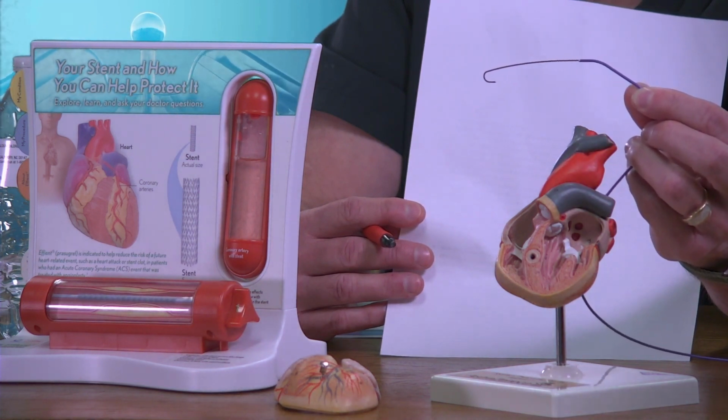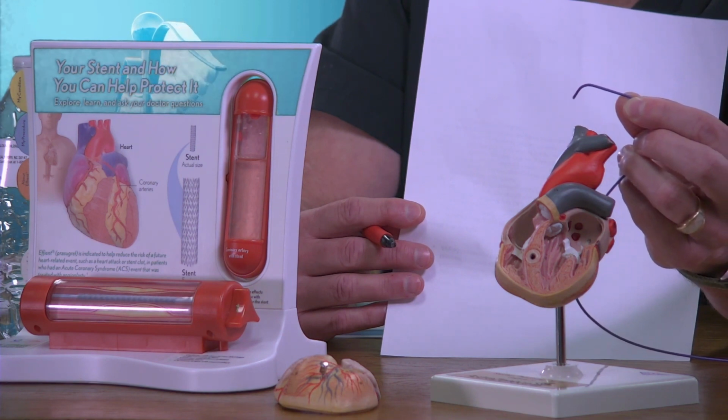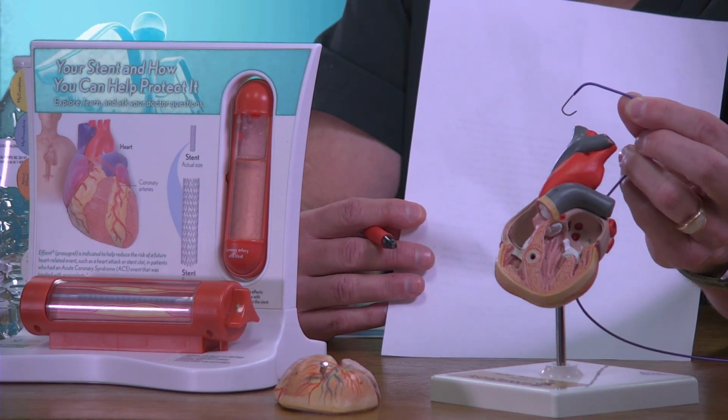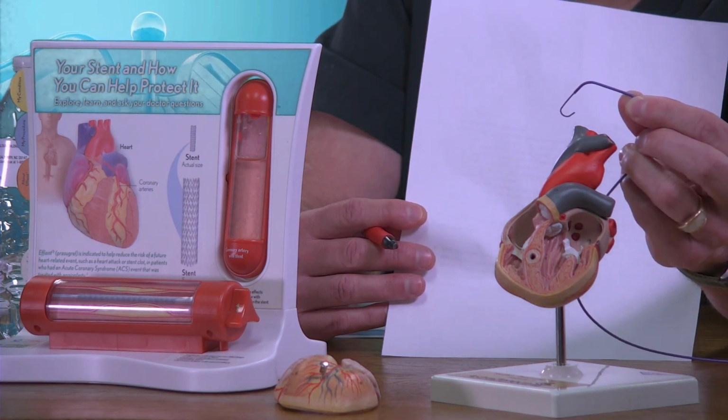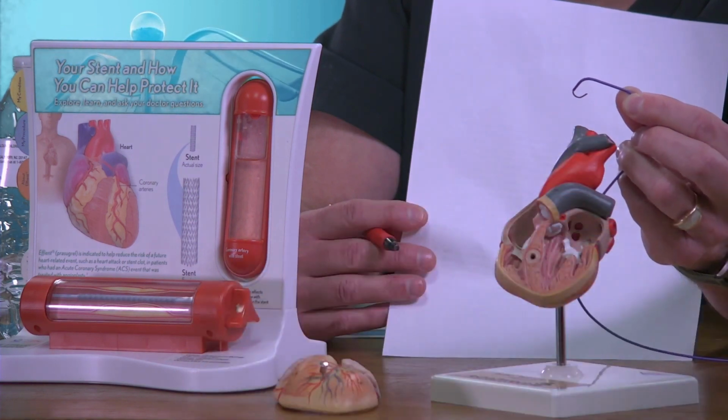Explain to us what this is doing. These are wires so that I can look at them on the fluoroscopy machine. Uh-huh. And what does that teach you? It tells me if I'm going the right way because not all arteries are straight. Some go like this, like this, like this. Gotcha. And so that helps direct you.